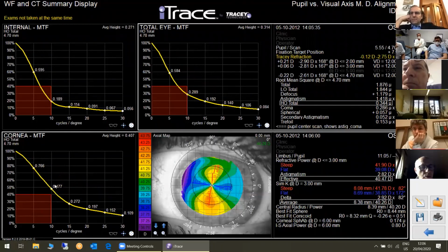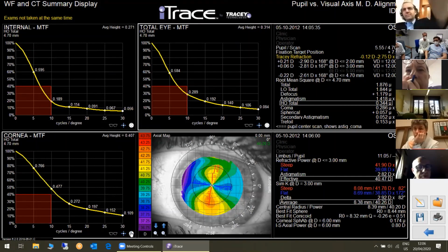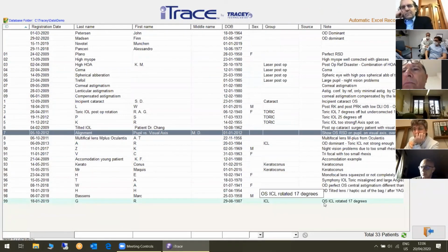But here you can see what it will do with a smaller scan size. So I would always take the natural scotopic pupil size and then look at the MTF. If the MTF is not good enough and the patient has large pupils, you can tell them that with multifocal or trifocal, the image might not be perfect, but during the day it will be better. And sometimes they say, okay, I understand this, and that's no problem for me.